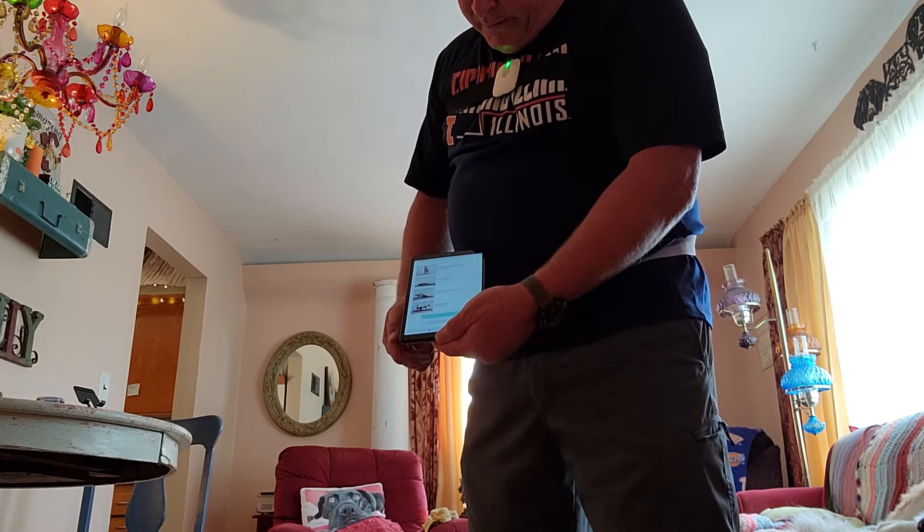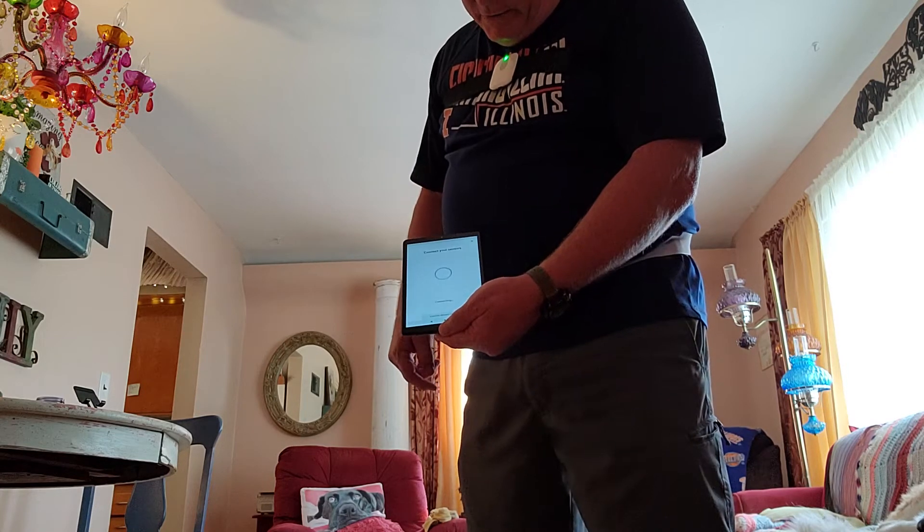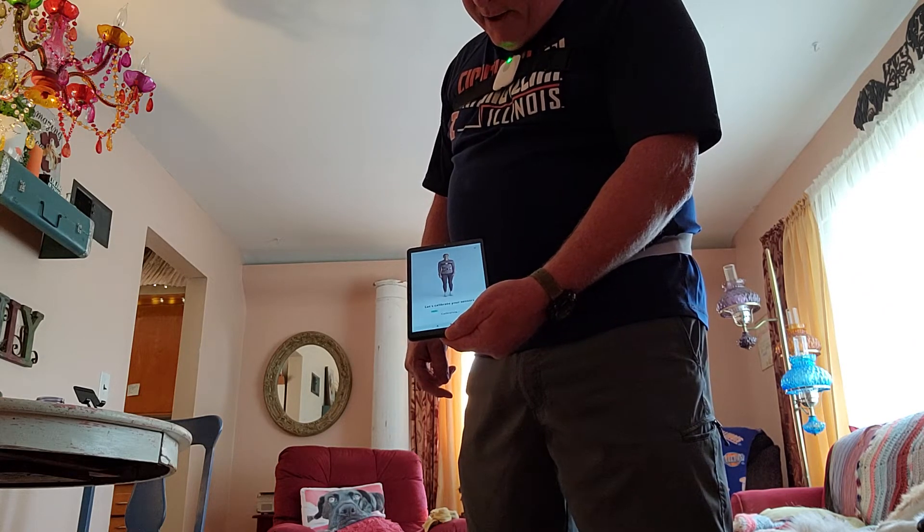So we're going to click begin, the sensors are on, and we're going to connect with sensors. It's connecting — bingo, it is connected. Now it's got to calibrate them.